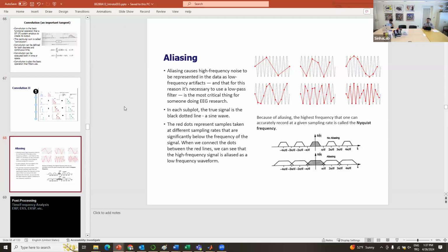Aliasing is basically, let me tell you this. If you're given a signal, whether discrete time or continuous time, it doesn't matter, and you want to sample your signal, for example, downsampling is one resampling technique. Downsampling means rather than taking all the samples, you take one sample at a time and then give a break.